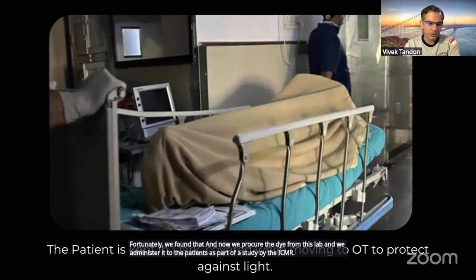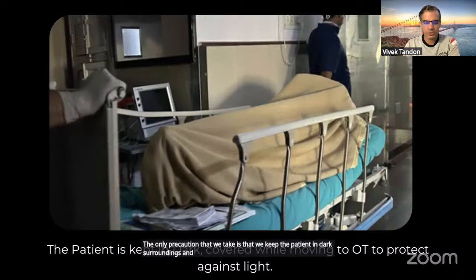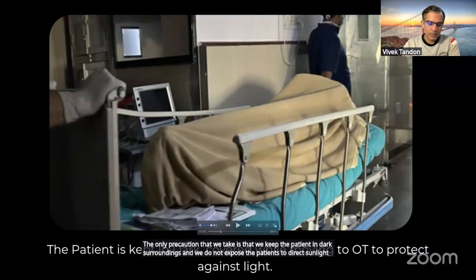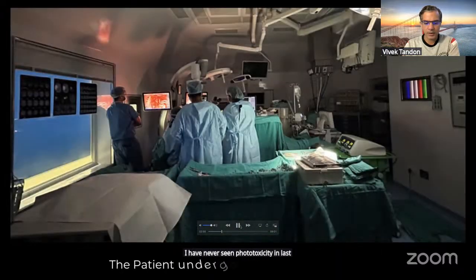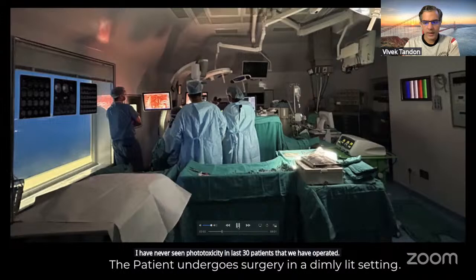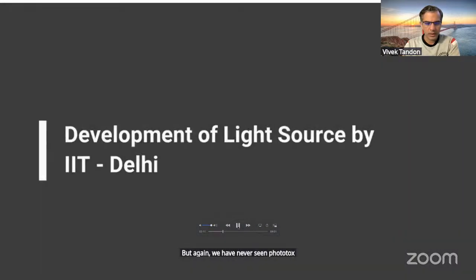The only precaution that we take is that we keep the patient in dark surroundings and we do not expose the patients to direct sunlight. But we realize that with the kind of ambient light that we have, even these precautions are not required, according to me. I have never seen phototoxicity in the last 30 patients that we have operated. We utilize dim settings in the operation theater as well, as you can see here. But again, we have never seen phototoxicity till now in our setting.